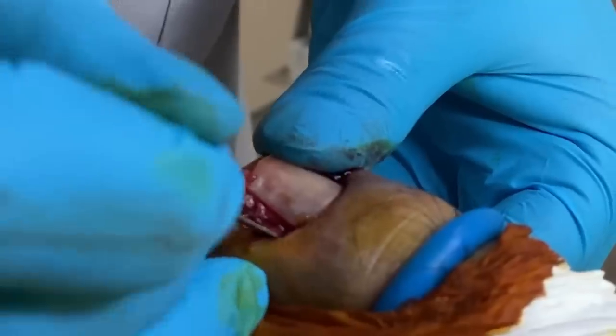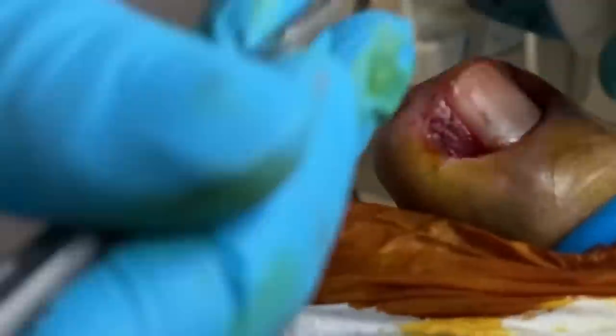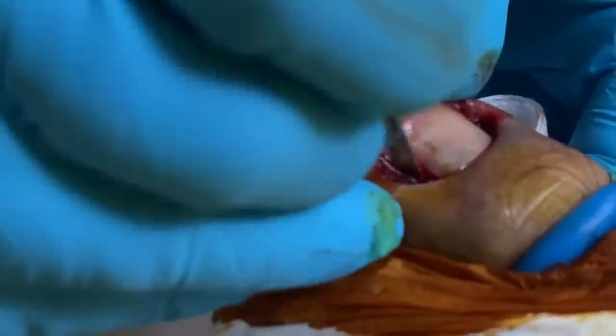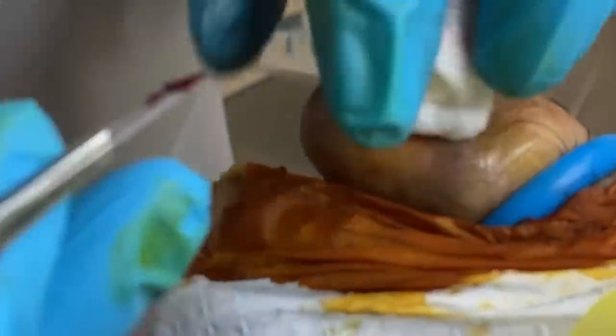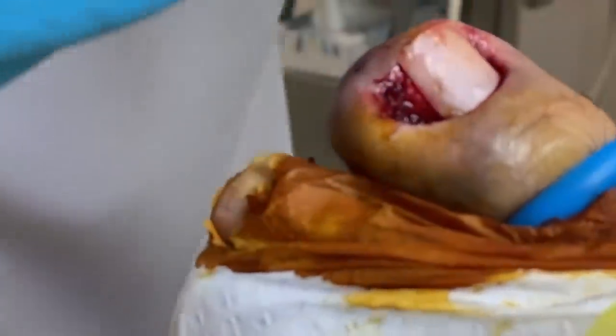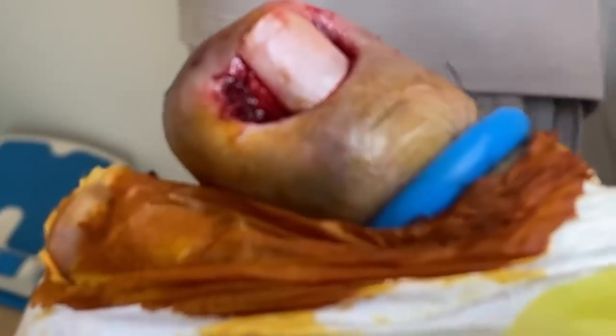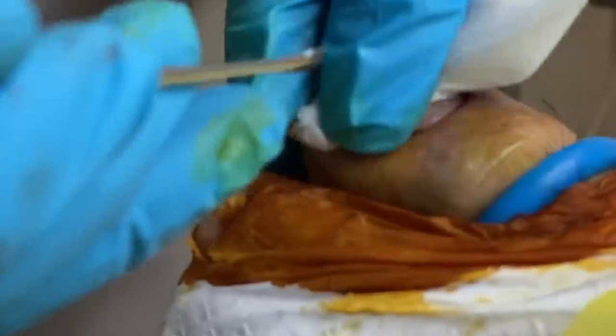We need to remove this hypergranulation tissue — it will cause a problem. I think the best way to take it out is to cut it out. Still some more left here; this is all the infection that's caused the tissue to be damaged. One of my favorite tools — a little scooper. I'm sure it's got a technical name.